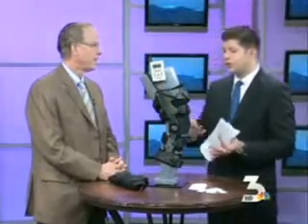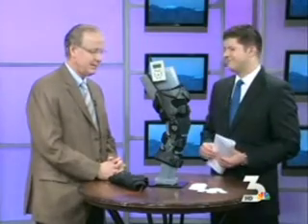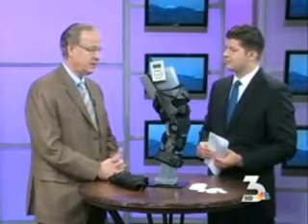You talked about how you treat athletes. Would this be something that could work for a basketball player, football player? Typically, this is something that we use for the older weekend warrior, but it can be used literally in anyone that has an arthritic or an osteoarthritic condition.